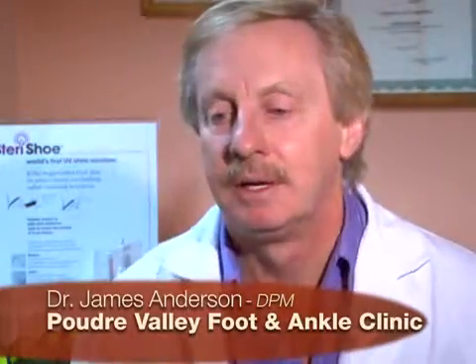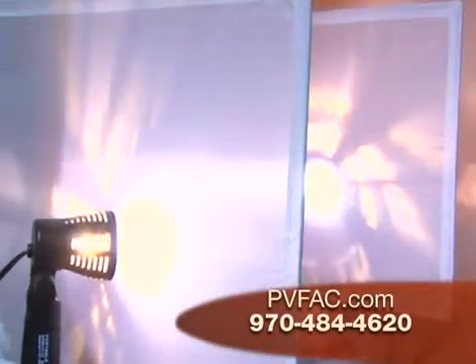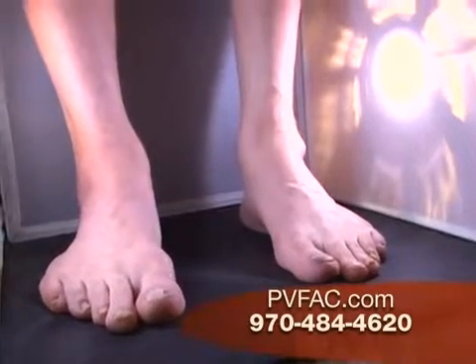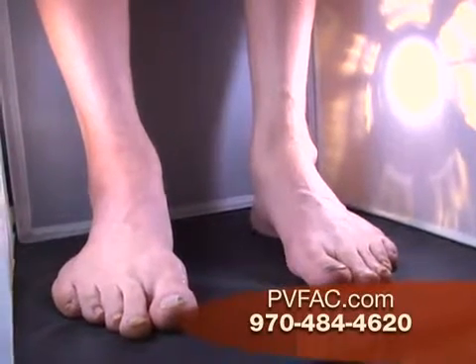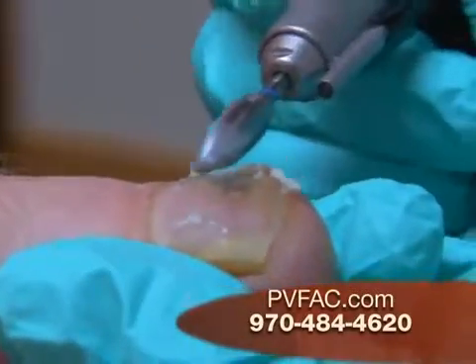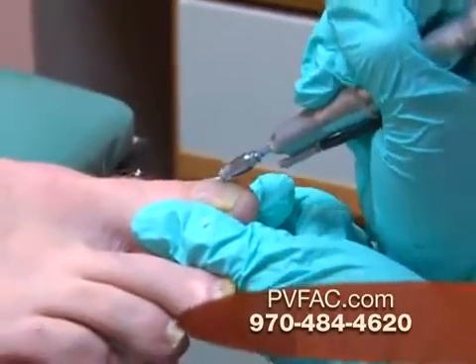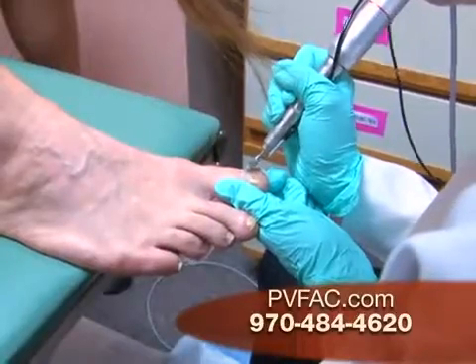So, Janice, the way the procedure works, when somebody comes in to have this performed, one of the first things we do is take pictures. We have before pictures, because we're going to take pictures at 4 months and then at 9 months for comparison, and sometimes at 12 months. Another thing we might do, if the nail is very thickened, is grind it down a little bit. This is a very pain-free way to trim some of the debris off the nail and get down to the main part of the nail. We think that's an important part of the treatment. We have a little grinder device that sprays alcohol and water, so as it's grinding your nail, it tends not to heat up, and it's very pain-free again.